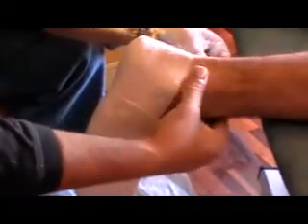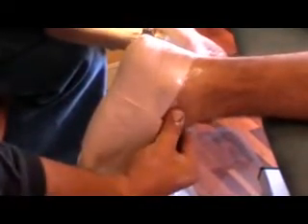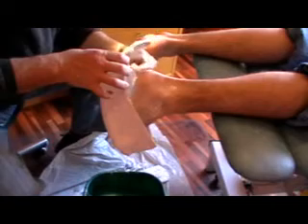There is a technique for taking the cast off correctly. You need to pinch the skin and separate it from the inside of the cast. Spread your fingers evenly around the rim of the cast and pull towards you with an even pressure. Once you see the plantar aspect of the heel, you can cup the heel of the cast and push straight down and rotate at the same time.